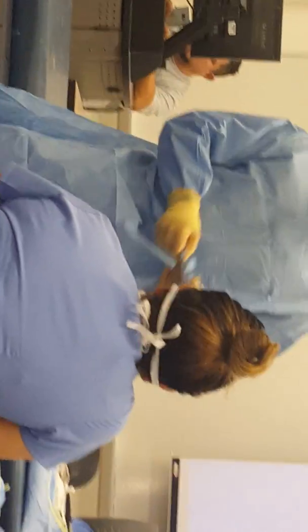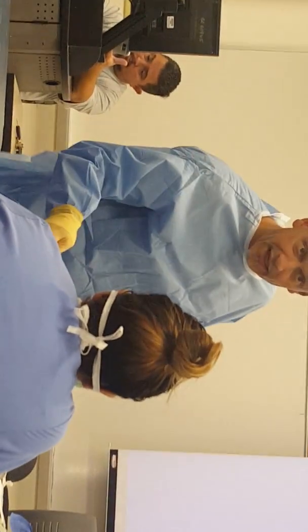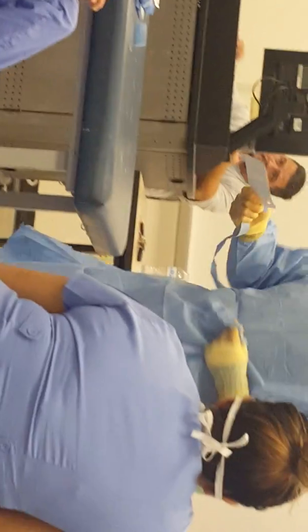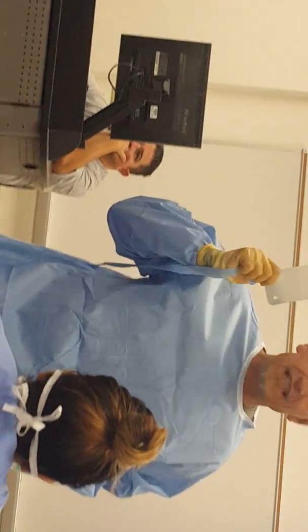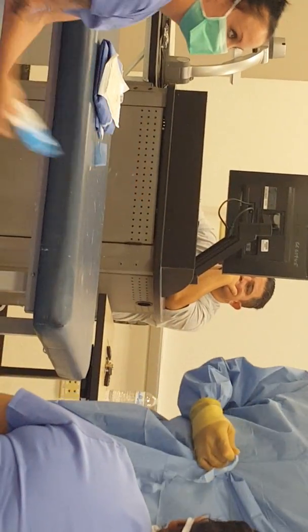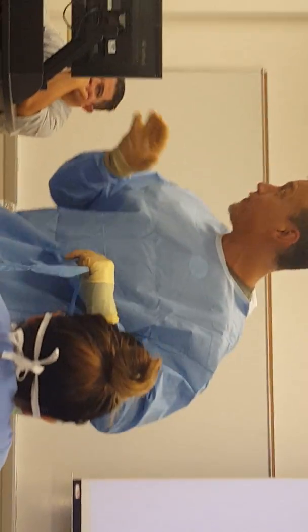Nobody? No one's fighting? The short end. This is the long end. Got it? Take the short end out. Remember, it's divided in half. I showed you this once before, so that someone unsterile can grip the white half and stay way away from you on the blue half. Or I can hand it to someone sterile. It really doesn't matter. The key thing is once I hand it to you, because you will be handed these, you hold on to it like a death grip. Hold on to it. See that? Because sometimes when I pull that out, it flings with me. Now that's contaminated, contaminates me, contaminates my gown. It's nasty. It's not a good way to start off your day.